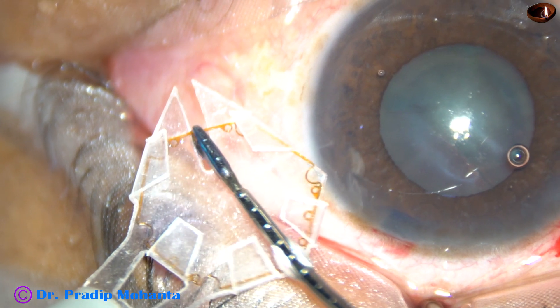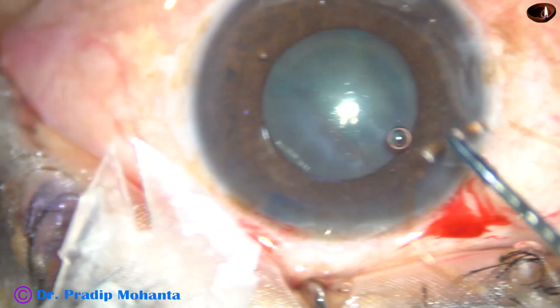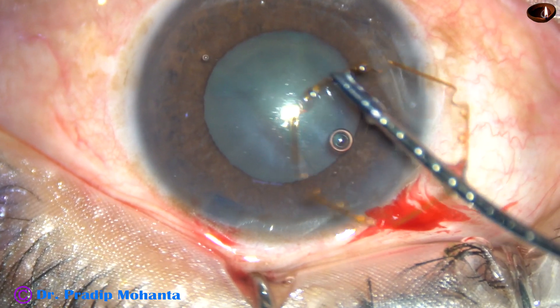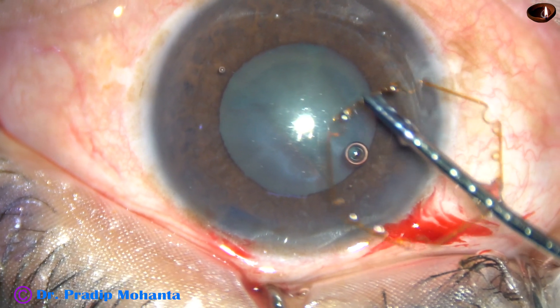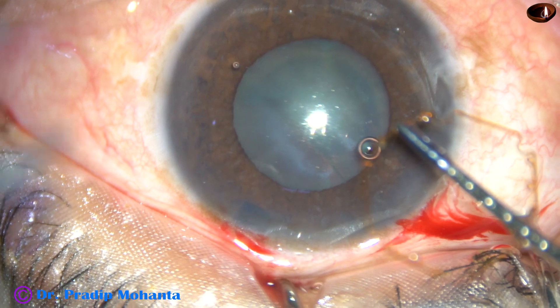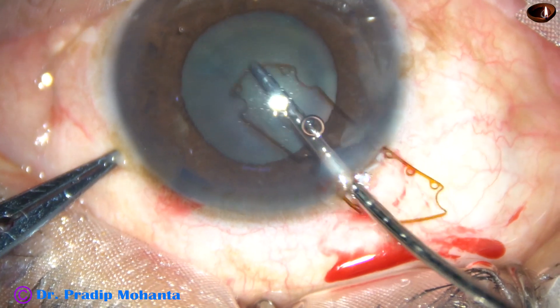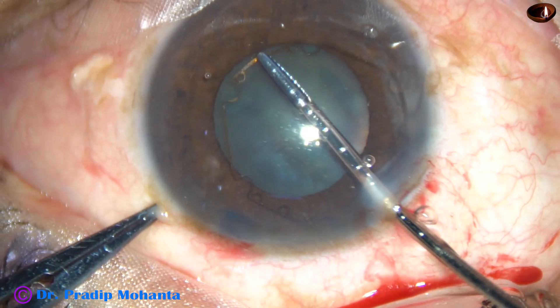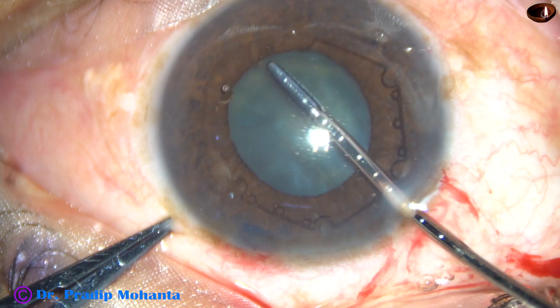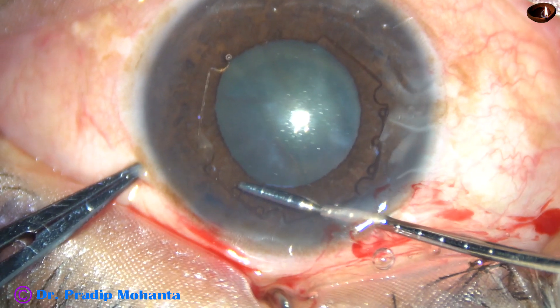And now this is the beautiful pupil expansion device, B-hex. The middle tab is held and now as the device goes totally into the anterior chamber, you can tuck the leading flange on-the-go as it happened in this case. See it here. Take the device totally into the anterior chamber. It has gone into the anterior chamber and now the leading flange is being tucked with the help of B-hex forceps.